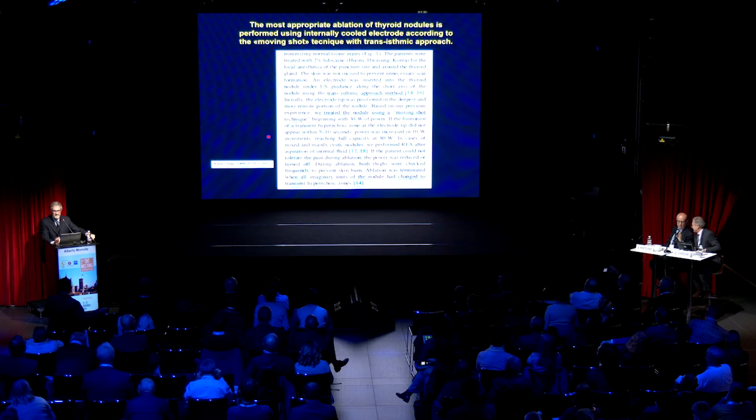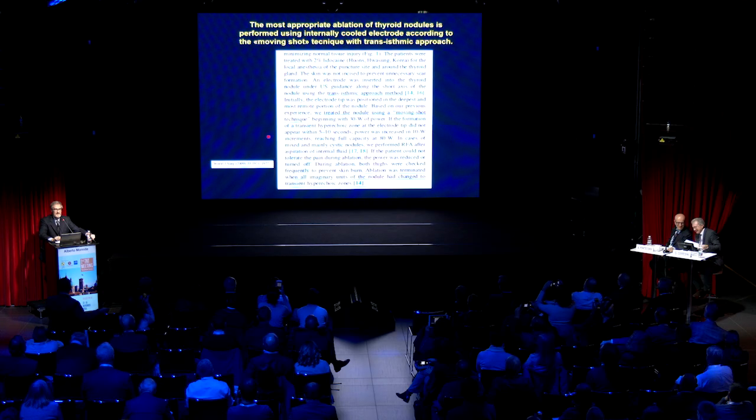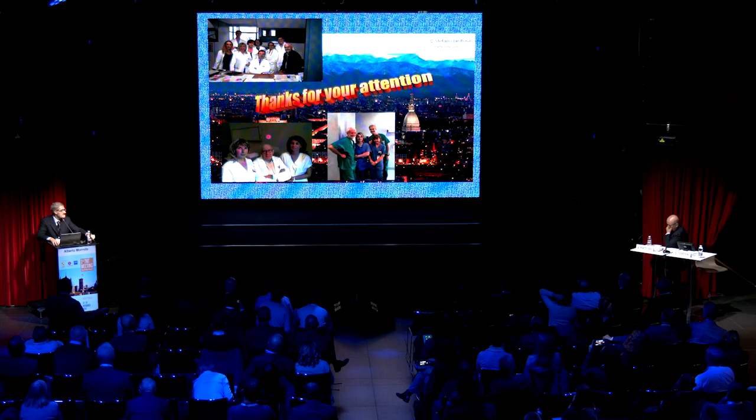For all these aspects, I think that now, for radiofrequency thermal ablation of the thyroid, the most appropriate ablation is using an internal cooled electrode with the moving shot technique and transisthmic approach. Thanks for your attention.